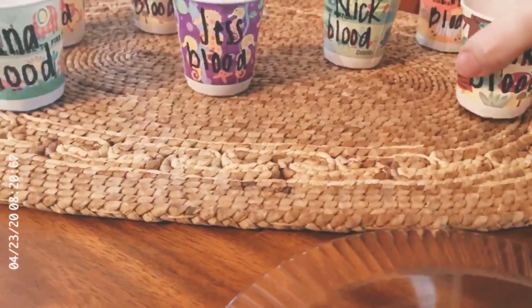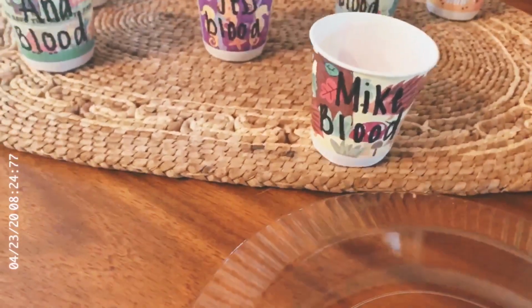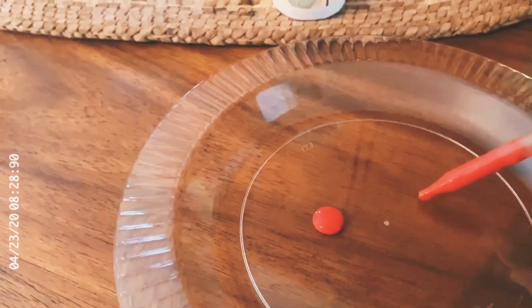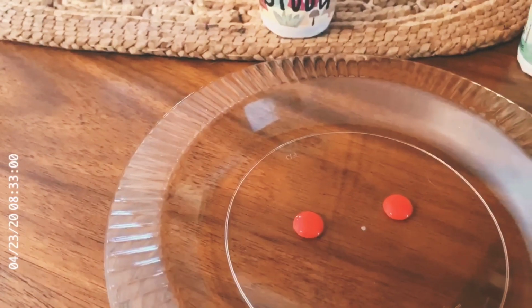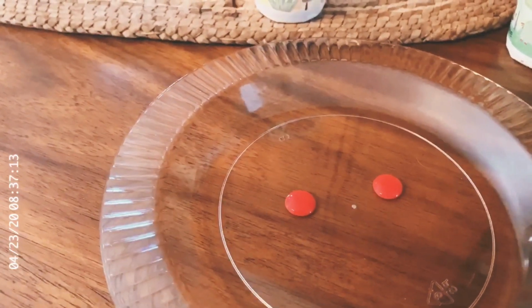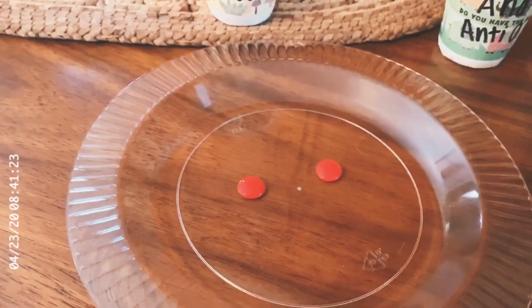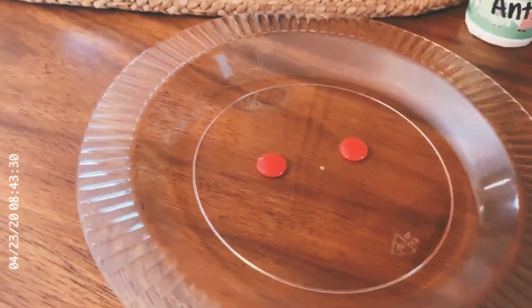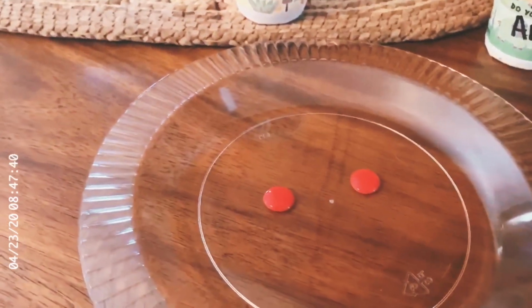Let's go with Mike. We'll get Mike's blood up here. Again, we're gonna take a sample. We'll do 2 drops on our sample plate. 1, 2. I'm gonna clear out our pipette. We gotta do his anti-serum A and anti-serum B. I'm always going to do A on the left and B on the right just to kind of keep it uniform. So let's go ahead and find Mike's A and B.